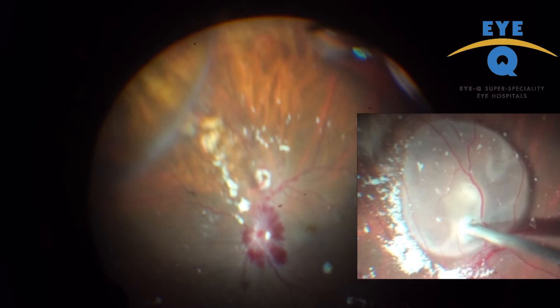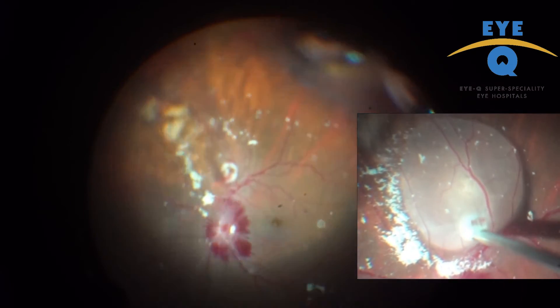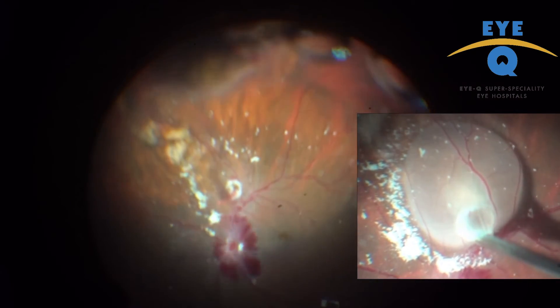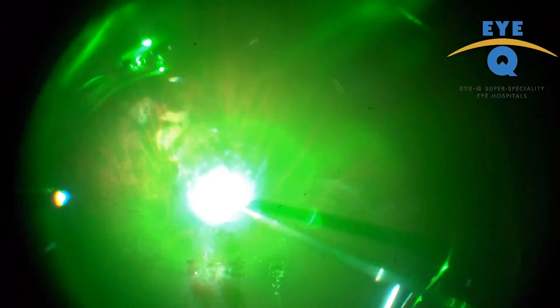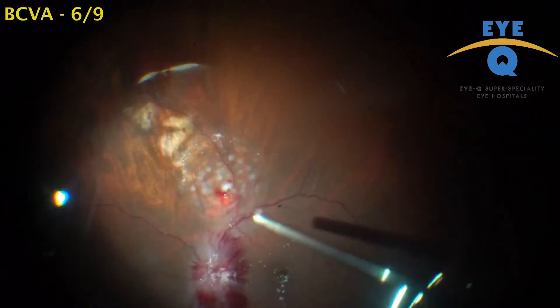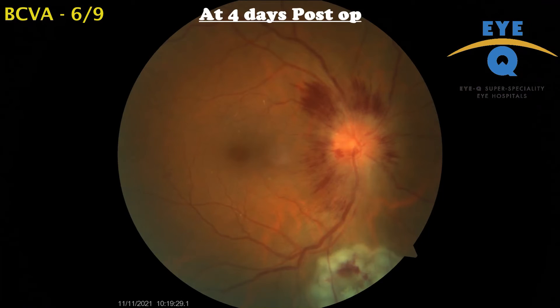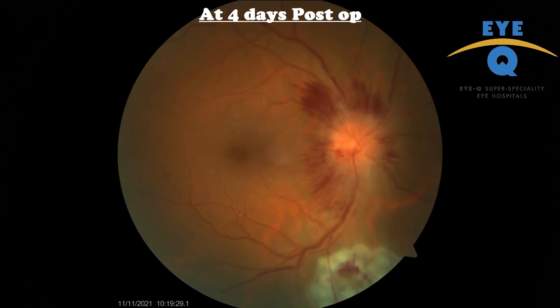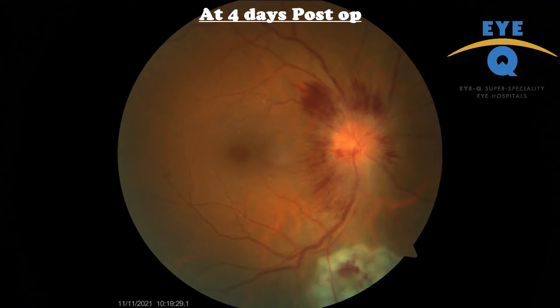One can also notice the characteristic movement of a live cyst once the wall is grasped. Normally this retinotomy can seal itself by fibrosis, but to be on the safer side, endo laser was applied to the site of retinotomy.